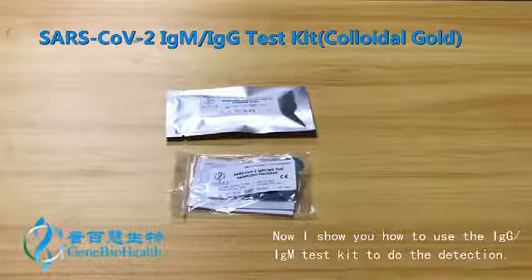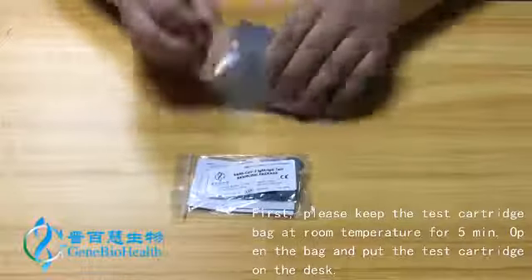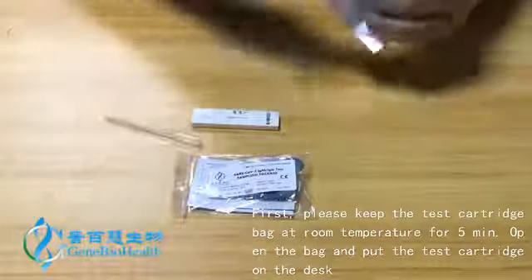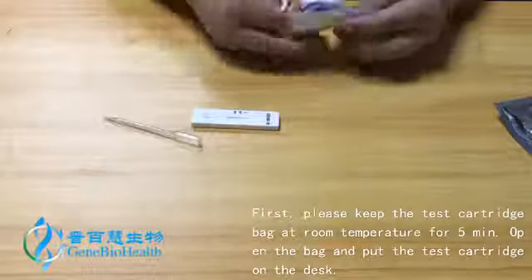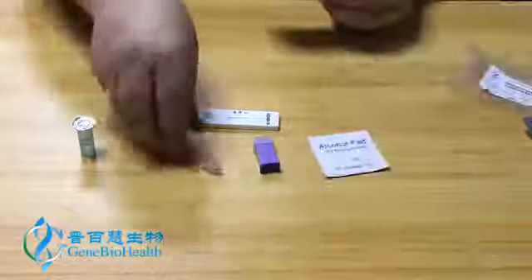Now I show you how to use the IgG IgM test kit to do the detection. First, please keep the test cartridge bag at room temperature for 5 minutes. Open the bag and put the test cartridge on the desk.